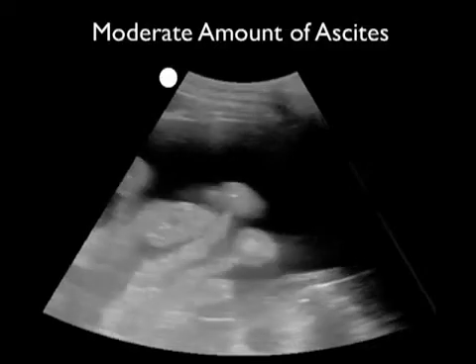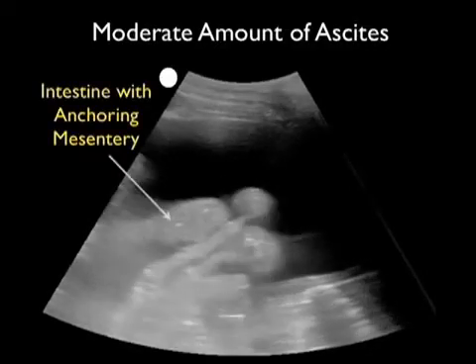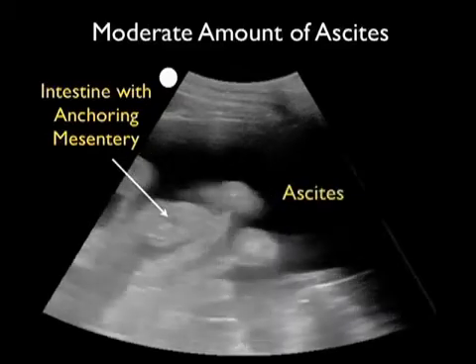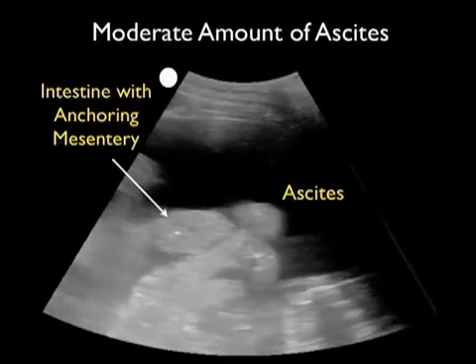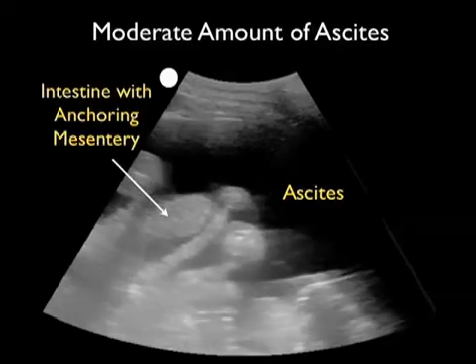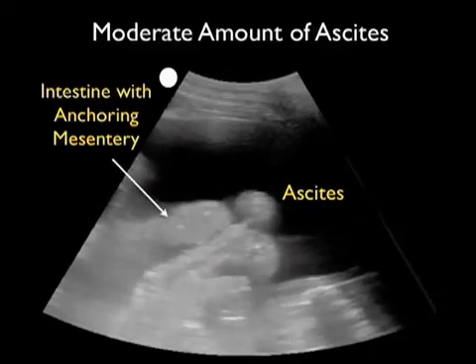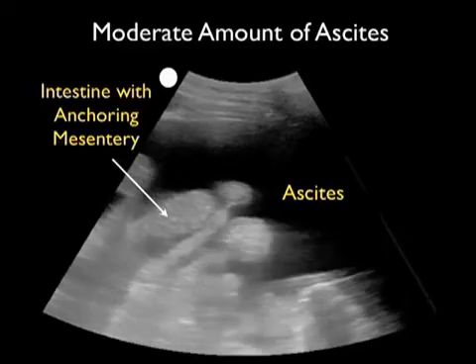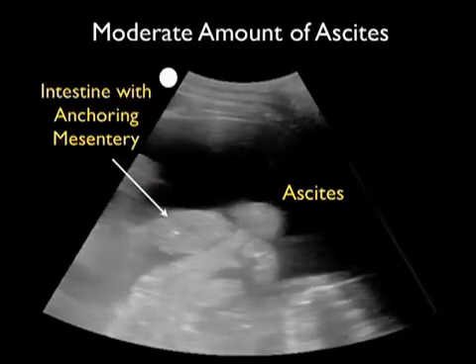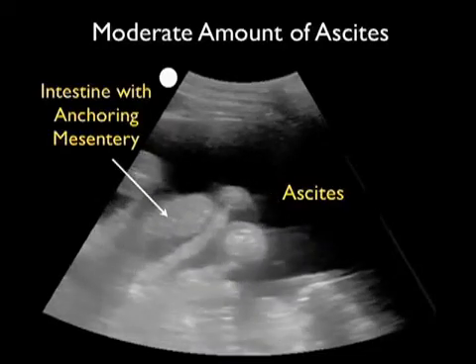This video shows a moderate amount of ascites, again taken with a 3 MHz probe. We note the intestine with anchoring mesentery sliding back and forth as the patient breathes, and we see a large collection of ascites — that dark or anechoic fluid collection — anterior to the intestine. This might be a good location to perform a paracentesis, as we could place the needle safely into the ascites without going through the intestine or anchoring mesentery.